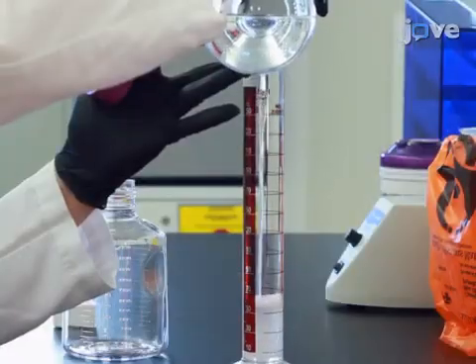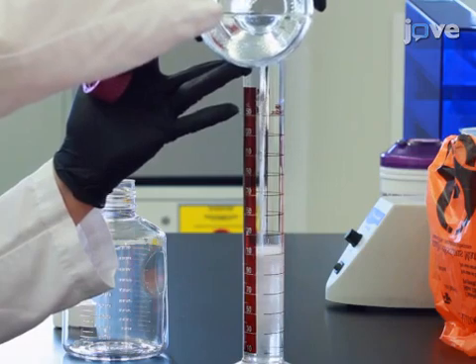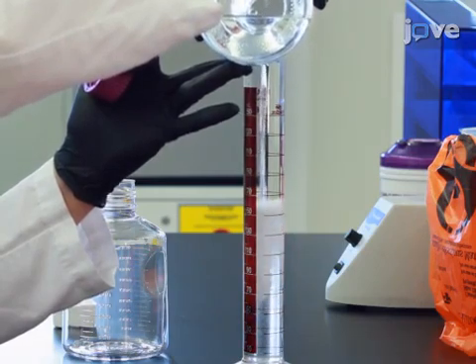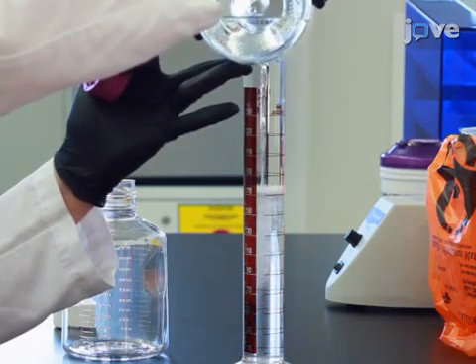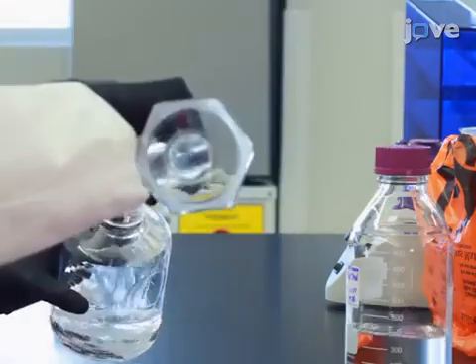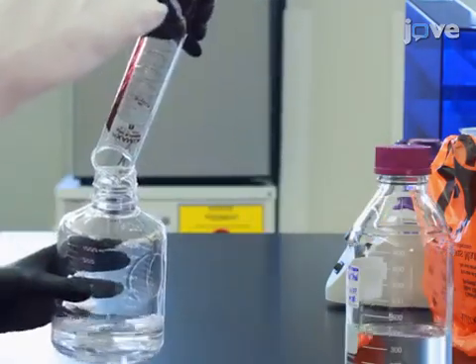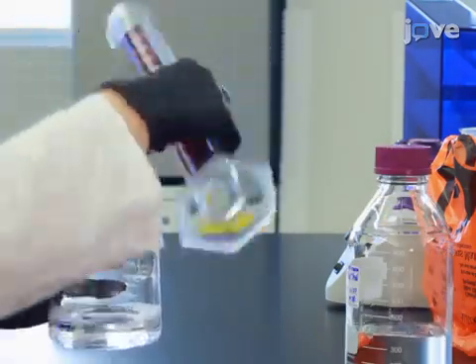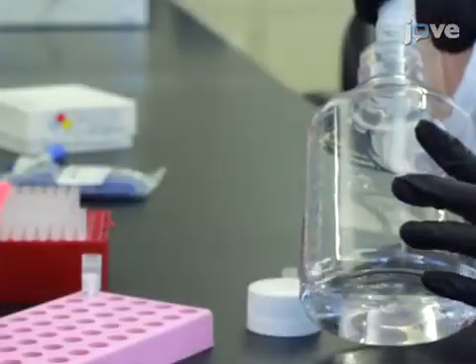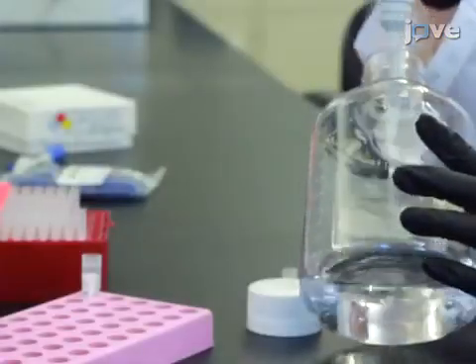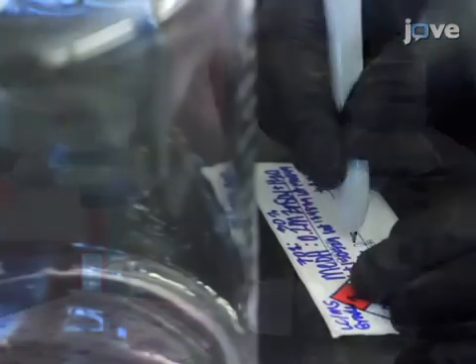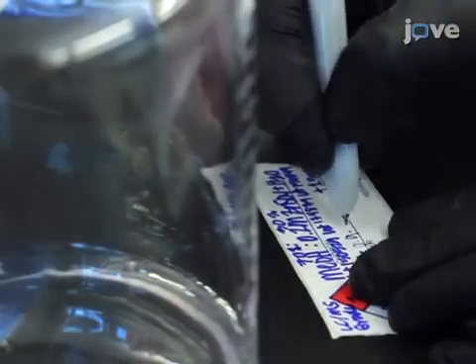On each extraction day, prepare a 7 to 3 ratio of methanol and 0.2 molar zinc sulfate in water to precipitate proteins and extract tacrolimus. The internal standard stock solution is spiked into the precipitation solution. Set the expiration of the solution at 12 hours.